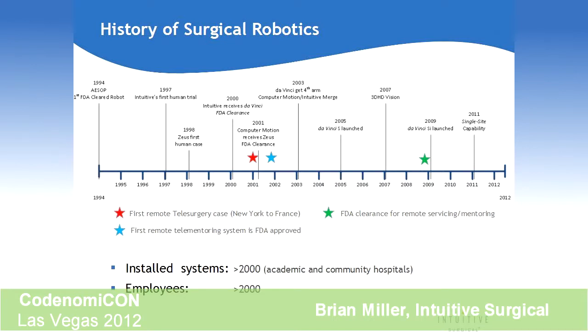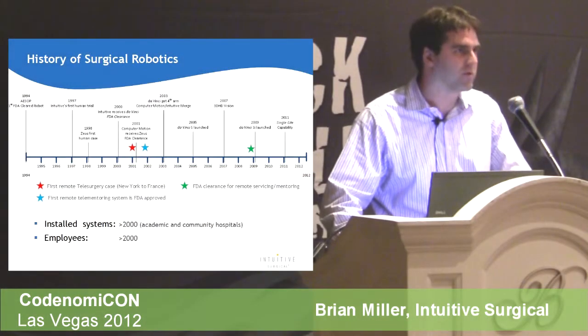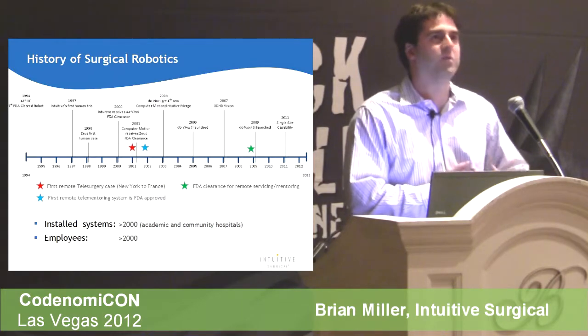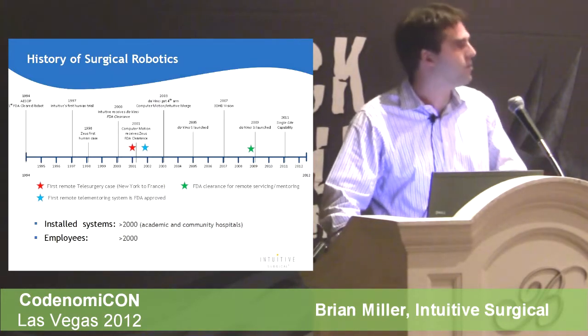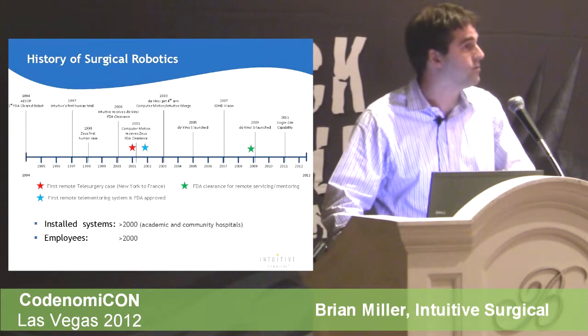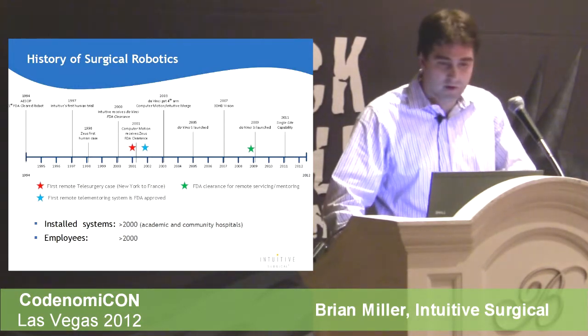The red star was the first remote case, the transatlantic Project Lindbergh case. As you can imagine, there was a lot of data going across the lines. There was the robotic control data, which was pretty small in amount, but then there was video going across, video of the endoscopic view. There was room video going across as well. These are all things that, as you look at how the surgical robotic system will communicate across the network, show there are a lot of different data sources required to support the applications.